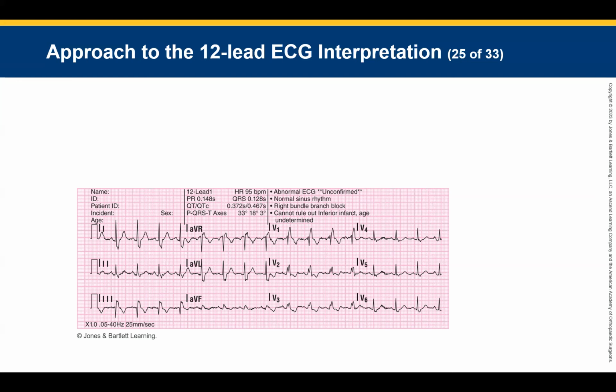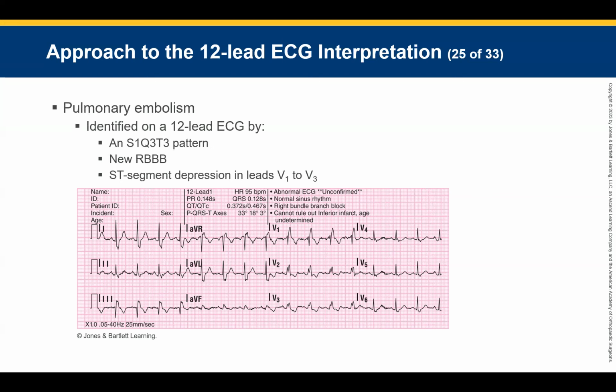I'm on the way to the hospital. This patient looks like junk. We know it's a bundle branch. I'm not getting too worked up, but we're going to the cardiac center. Now I get out that criteria and say, could this be a STEMI or is it most likely not a STEMI? That's when we would go to Sgarbossa, but we're not there yet. This is some complicated stuff, but I don't want you to even try to remember it, okay?